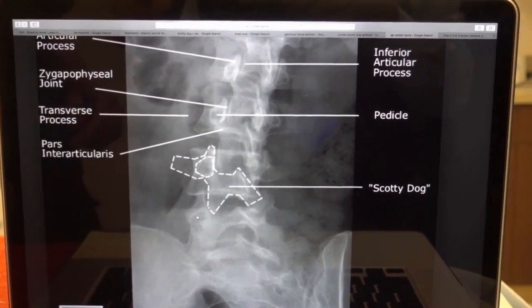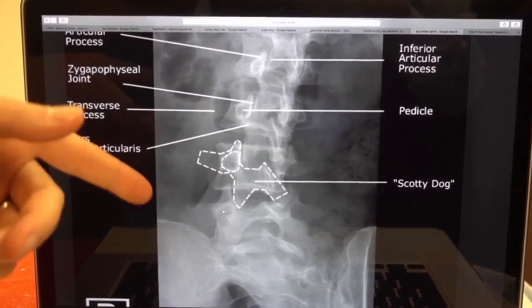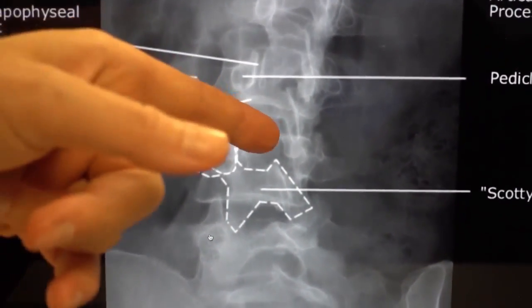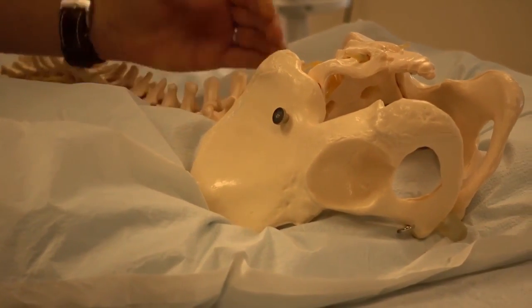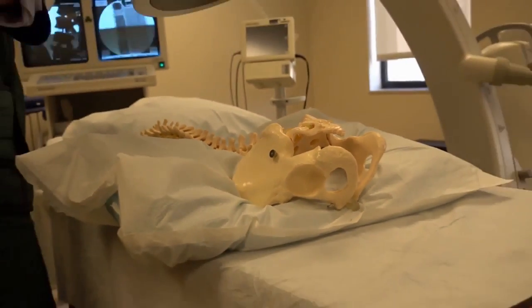Okay. One thing about knowing where the projection is, one way to know if you're oblique or if you're AP is looking at the spinous process itself. This is the spinous process, which is this part of the anatomy, this thing that you can reach back there and press on and feel in a thin person. This thing, when it's looking right down the spine, should project just vertically. You just see like a fin.